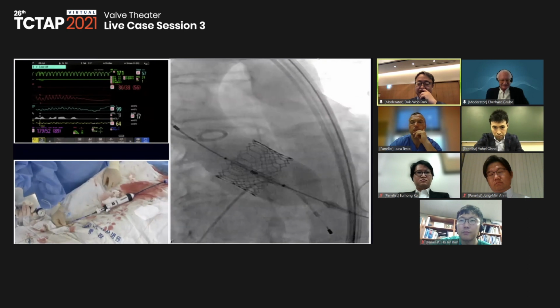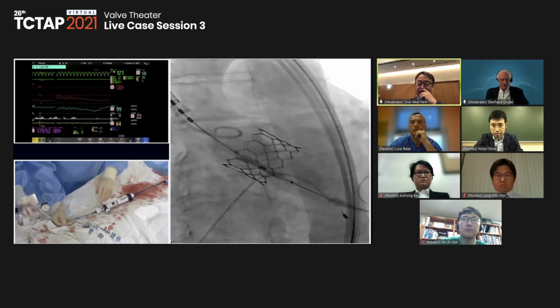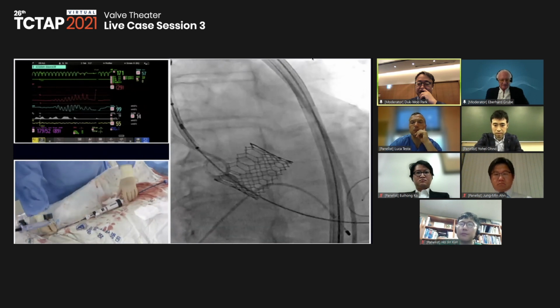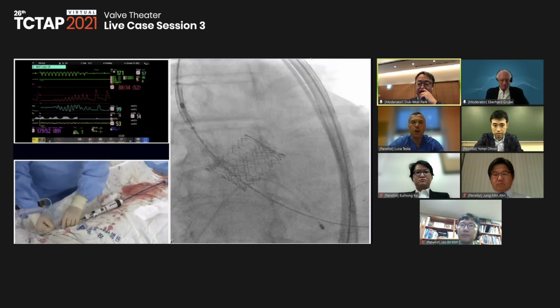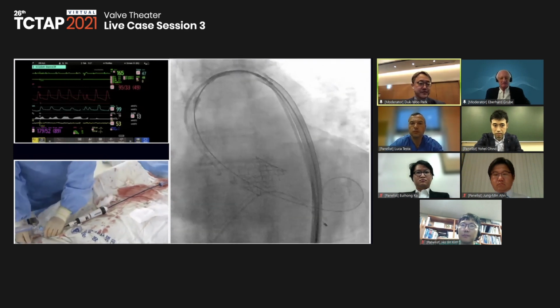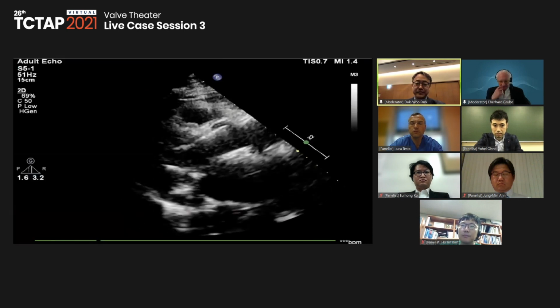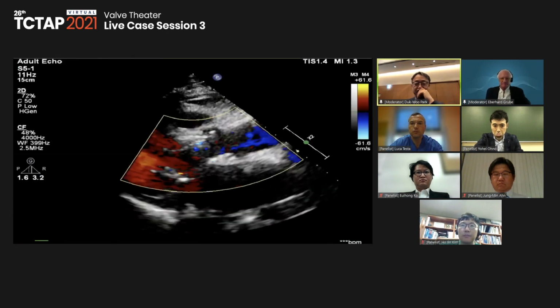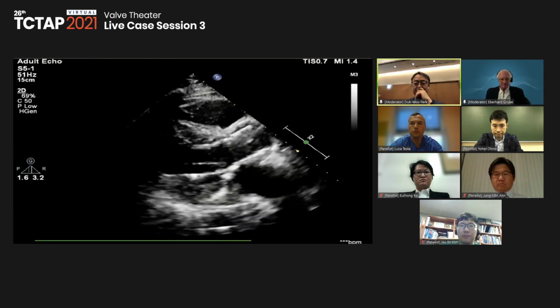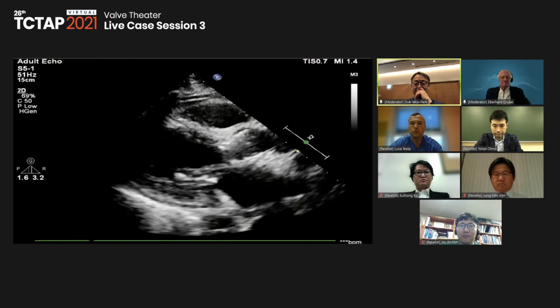1, 2, 3, 4, 5. Pacing up. Deflate. Okay. Pacing off. Okay, got it. Then remove slightly. Okay. Remove slightly. Esophageal echo, transthoracic echo. His view is excellent. And he is in a better than usual day.